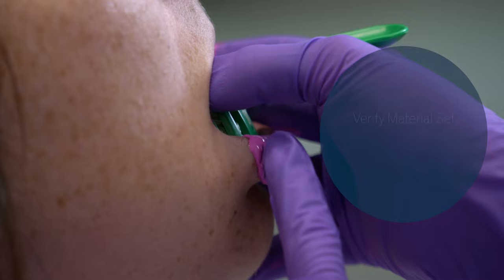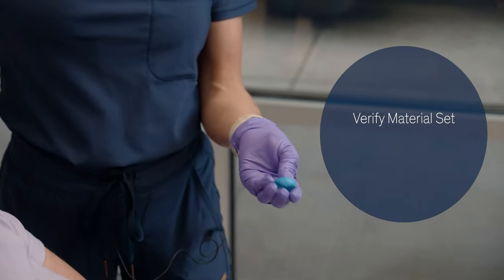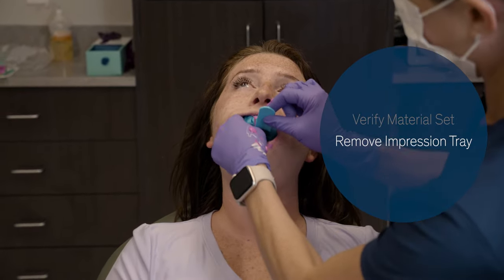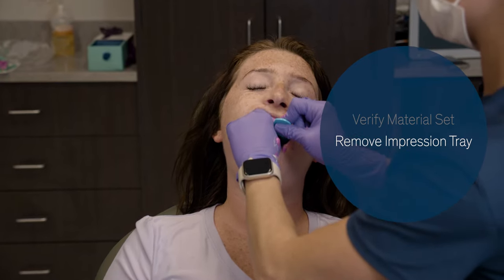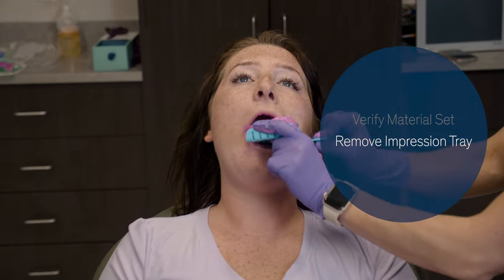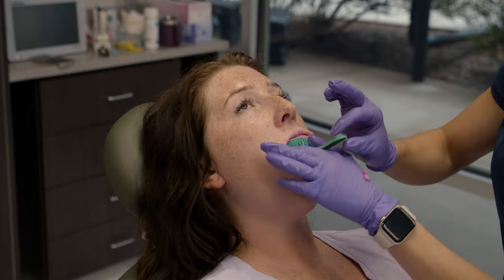Before removing the impression tray, verify that both light body and heavy body material — or putty and light body material — has fully set up before removing the impression. If that material is set up, then the material in the patient's mouth will be set up as well, and the impression can be removed. If the impression was taken accurately, it may be difficult to remove. A great technique is to take your pointer finger and apply pressure to the side of the impression in the vestibule of the patient's mouth, applying pressure in a downward motion to help break the seal and allow the impression to be removed easier.